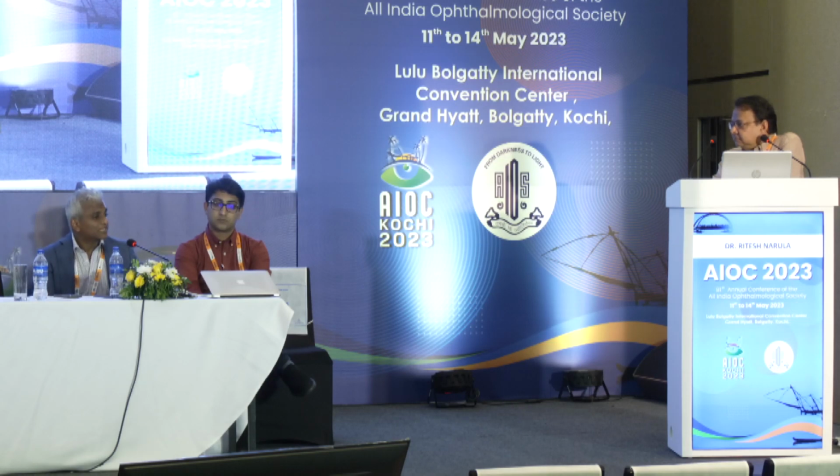At this point in time, I'm a glaucoma specialist, so there's much more value in retina to have this as a device, but it has still not become a definitive required tool in anyone's practice at this point in time.